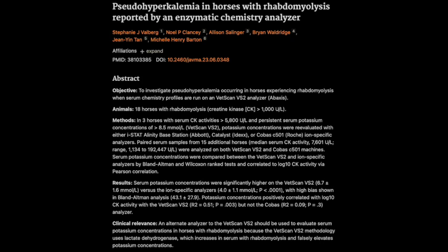Well, I'd say the most important thing is to be aware of this pseudohyperkalemia issue, especially in horses with rhabdomyolysis, and especially if you're using the VetScan VS2. Number two, always confirm any high potassium readings that seem a little fishy. Use a different method, like an analyzer with ion-specific electrodes. And number three, always think critically about those lab results. Don't just take them at face value. Look at the bigger picture. Consider the whole patient. Exactly. Because that's how we make sure we're giving our horses the best possible care.